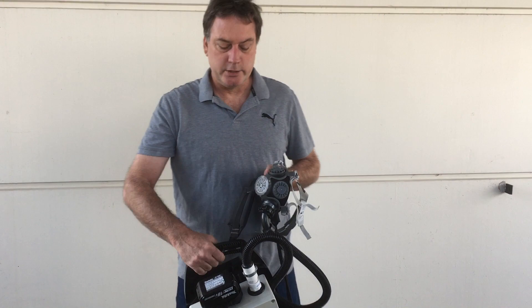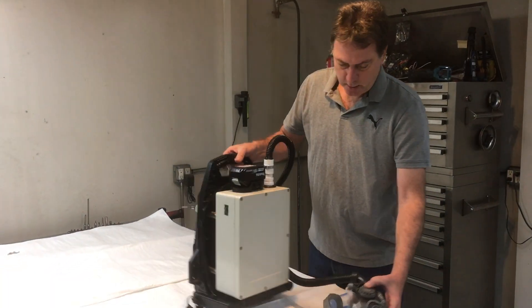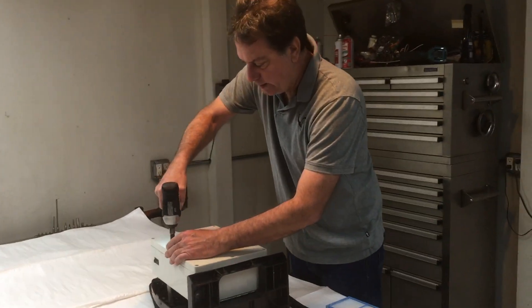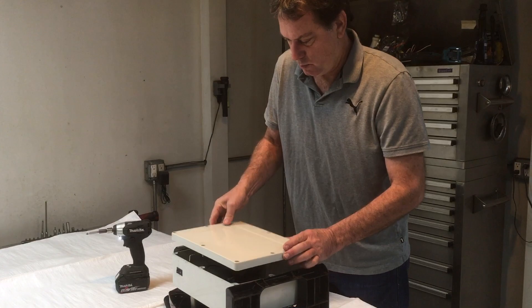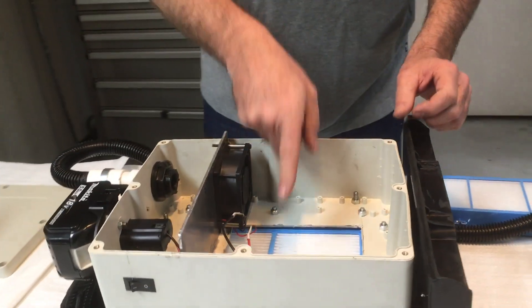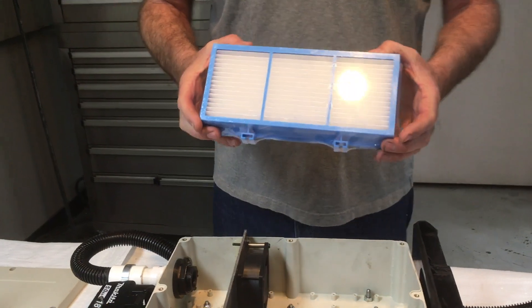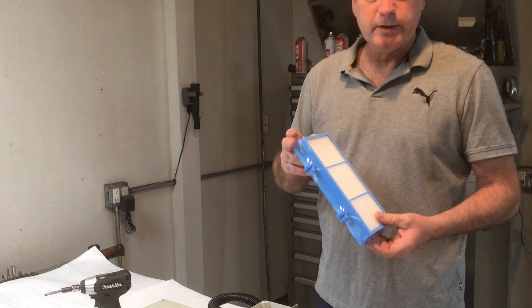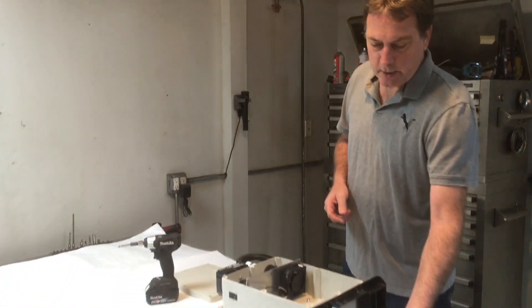Next we're going to go to the shop where I can show you more of a teardown of this. Okay, so opening this up — I've got most of the screws out already. Here's the inside. I have a cutout here for the filter. This is the filter I'm using — it's out of an air filtration unit. Basically you can order these replacement filters online.